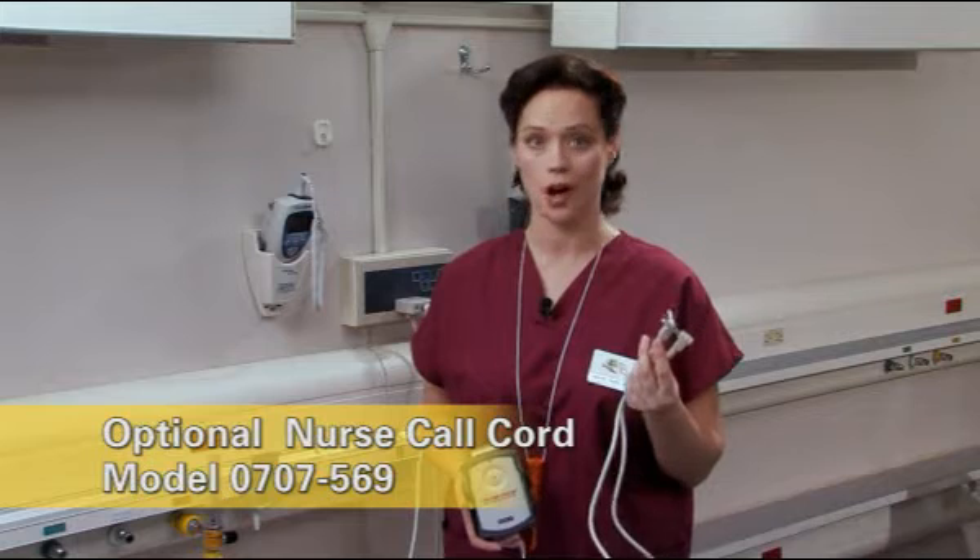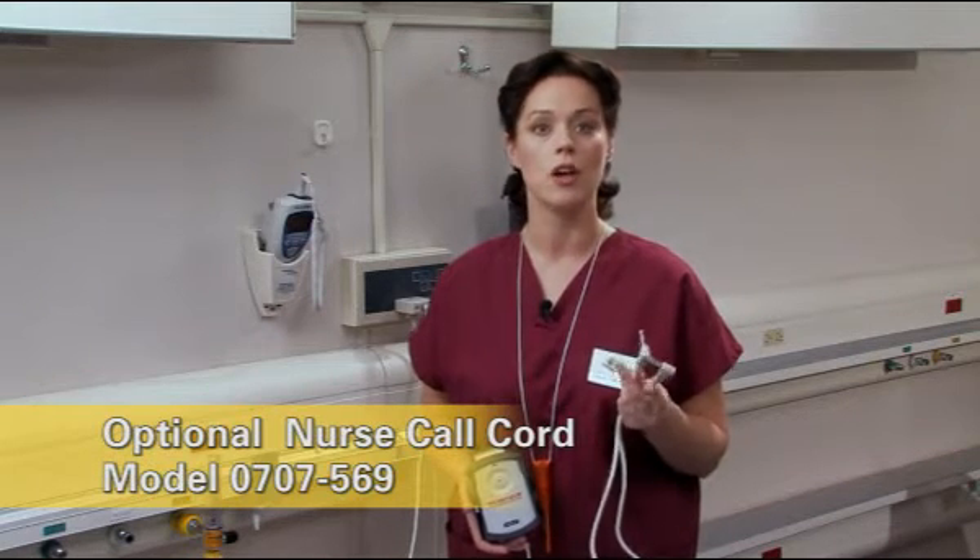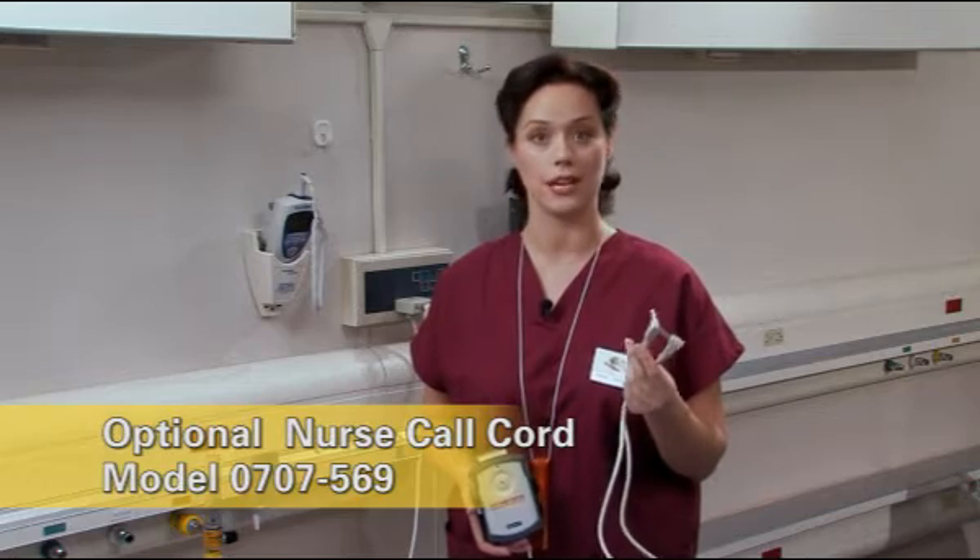Use the optional nurse call cord, model 0707569, with quarter-inch phone plugs on each end to interface the monitor to your system. If your system uses some other kind of plug, contact your distributor for an adapter.